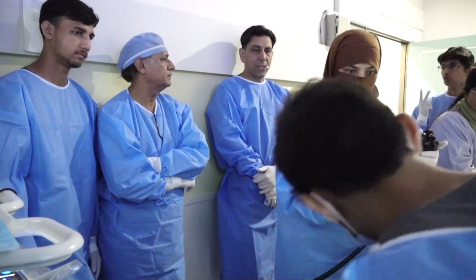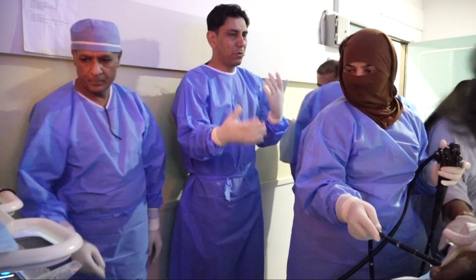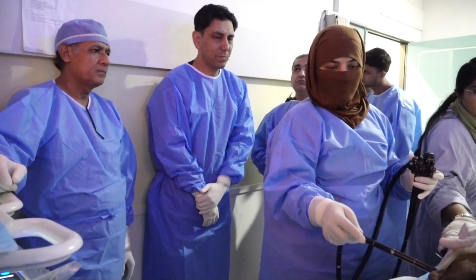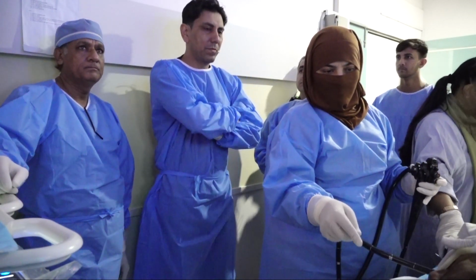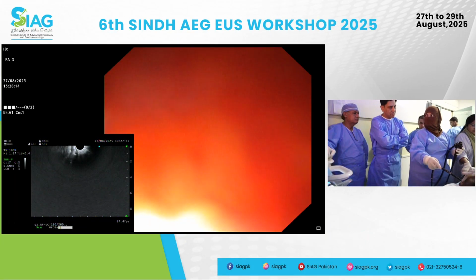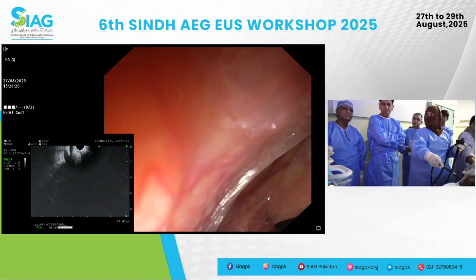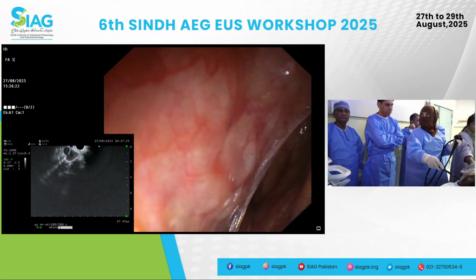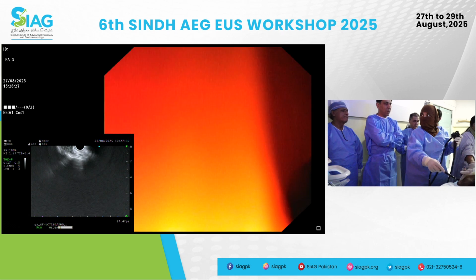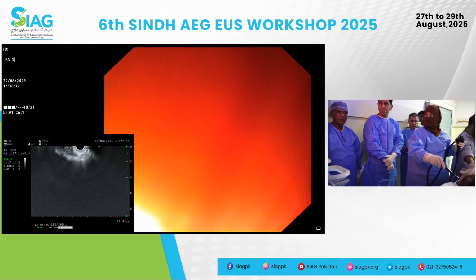So Seher is going to start the procedure. Seher, just for the benefit of the delegates in the room, what we would like to do is if you could just talk us through every step along the way, please. It's okay, that's fine. Let's big wheel up so that, tip down when you reach the posterior oropharynx, then you tip away or big wheel away from you.